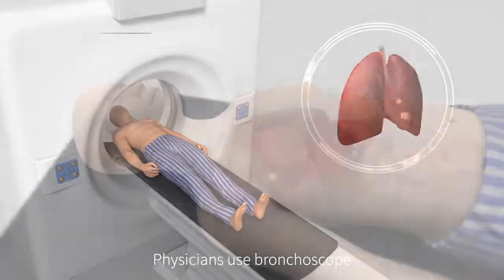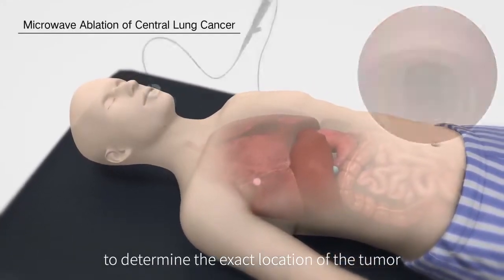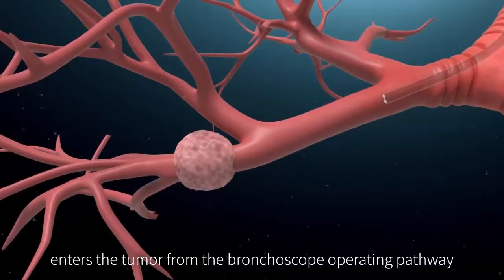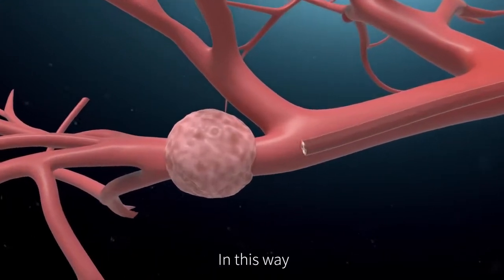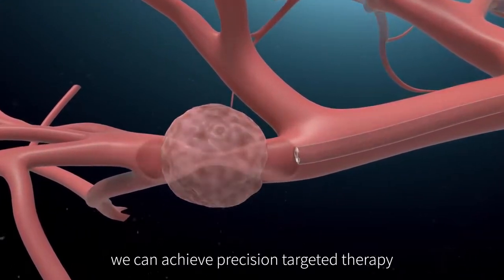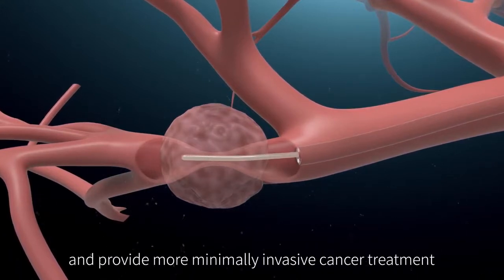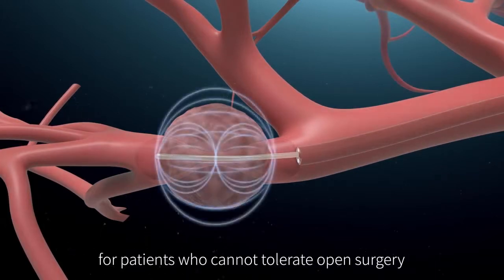Physicians use bronchoscope to determine the exact location of the tumor, and the bronchoscopic flexible microwave ablation antenna enters the tumor from the bronchoscope operating pathway. In this way, we can achieve precision-targeted therapy, reduce unnecessary side effects, and provide more minimally invasive cancer treatment for patients who cannot tolerate open surgery.